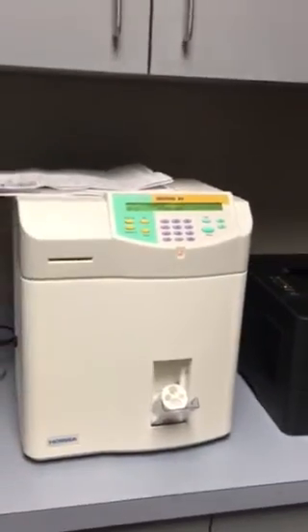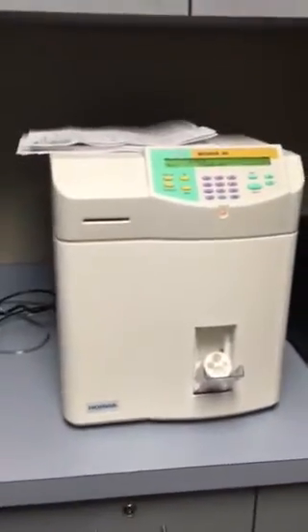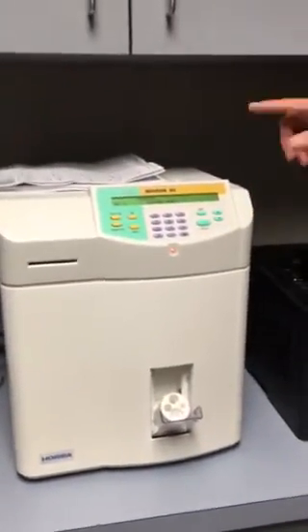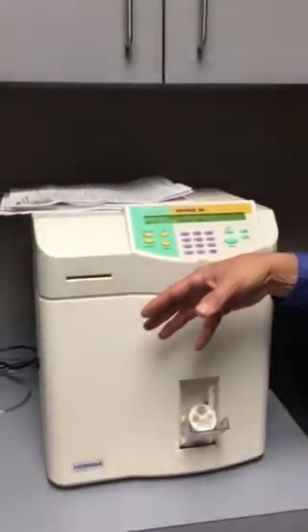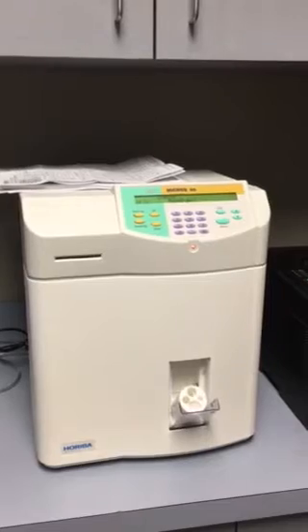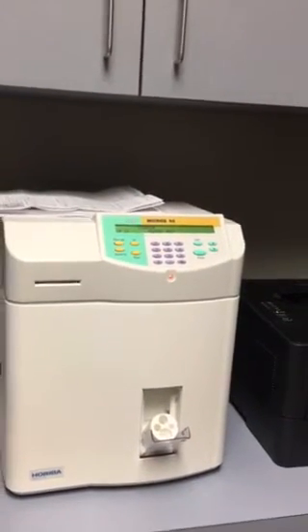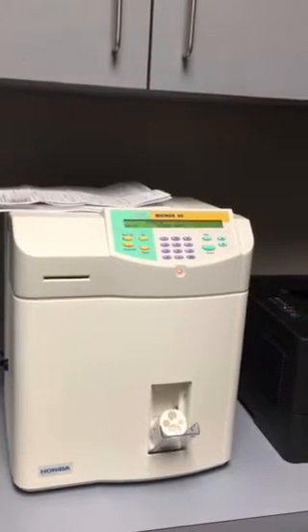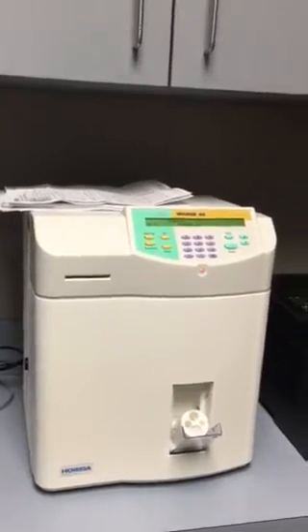In the morning when we open the lab, we open everything, turn this on, and make sure everything is set. After three minutes it will automatically do a startup. What the startup does is it rinses out your chambers — because we have cleaner sitting in the chambers overnight — then primes all your reagents, and runs a background count.